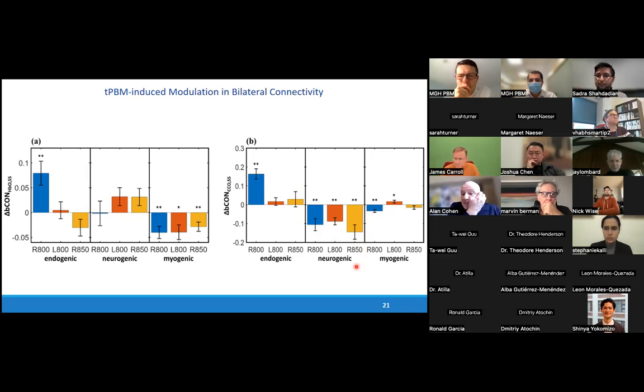So what I'm trying to show is that we have different options from different stimulation. If you want to locate your stimulation on one side and just get the specific result from that side, you can choose between these different stimulations. But if you want to get an effect globally or contralaterally, you can choose another type of stimulation. But this is just the first step. It needs to be investigated much further.